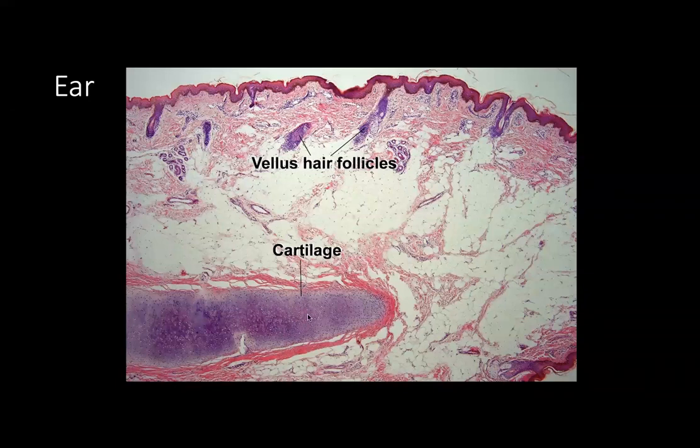And what happens is with chronic pressure on the ear, when patients are sleeping at night on the same side, that chronic pressure creates local ischemia. You actually get an ulcer developing with a fibrin deposition at the base of the ulcer. And sometimes you can see the cartilage actually extruding up into that ulcer, but not always, and most often you don't. So if you have a biopsy with a little ulcer, but no malignancy and some fibrinoid collection, you can think about chondrodermatitis nodularis helicis.